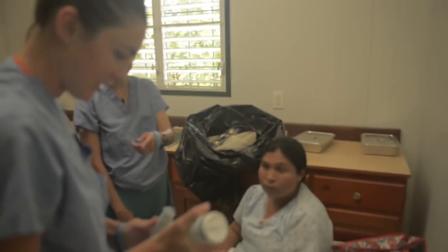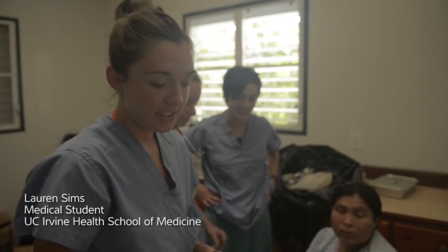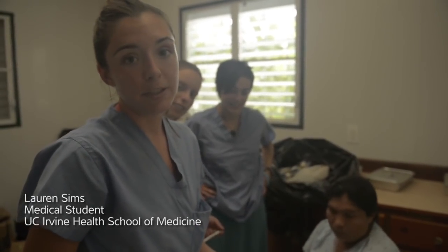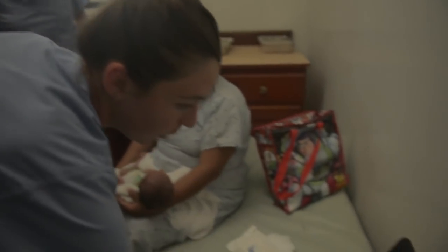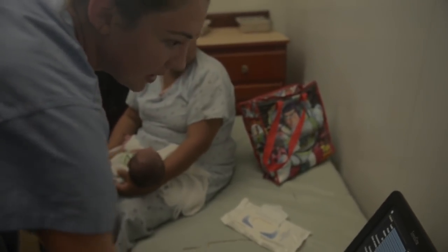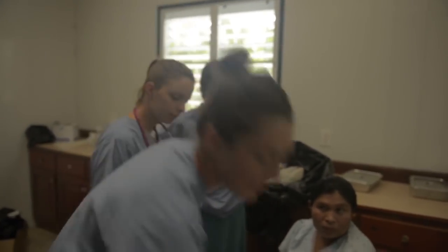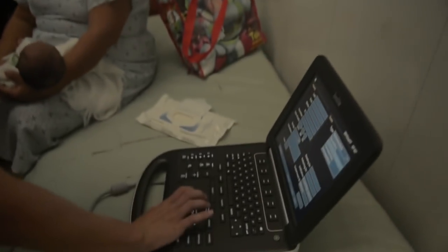We chose this machine because it has a neonatal probe. Once we put the neonatal probe on, the machine knows we're going to be scanning a baby, and we can select what scan we want to do — a nerve scan, abdomen, vascular, or a general neonatal scan. We're going to look at the liver and choose the abdomen right now.